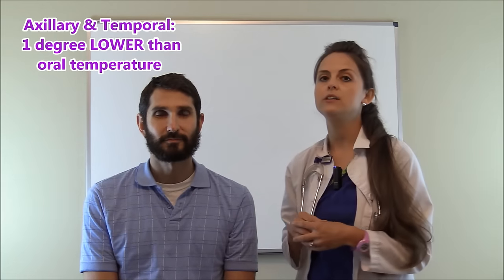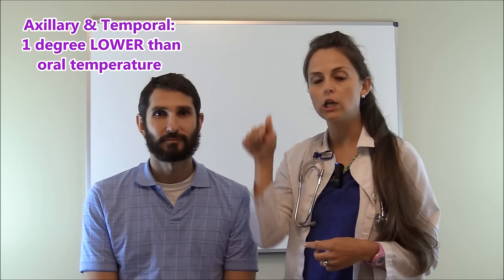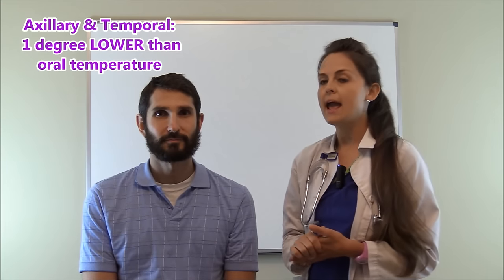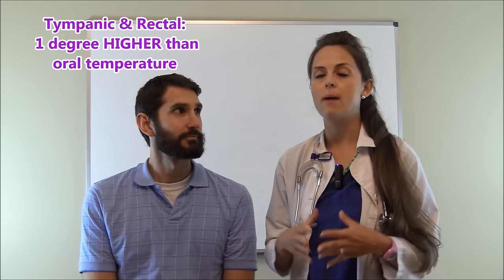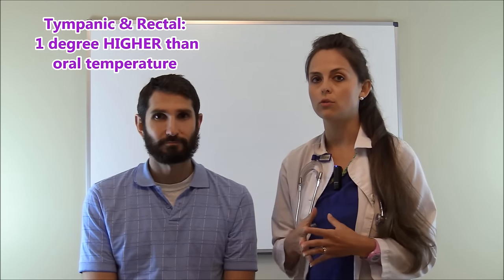Axillary and temporally the readings are going to run about one degree lower than oral and for tympanic and rectal temperatures it's going to usually run about one degree higher than your oral reading.